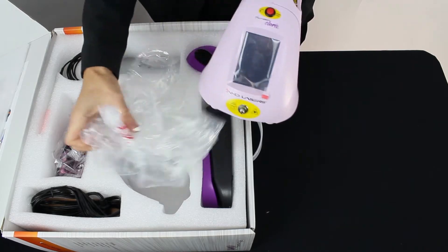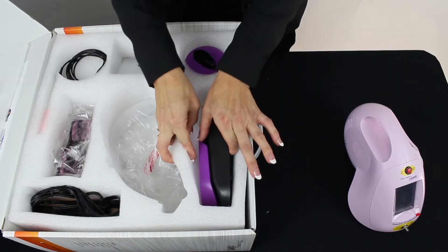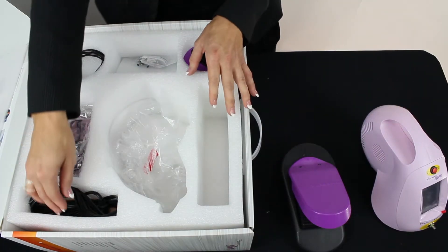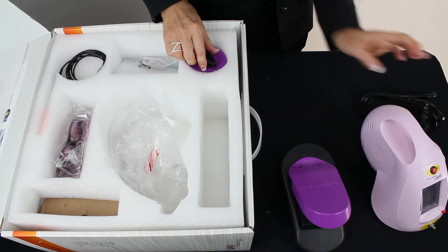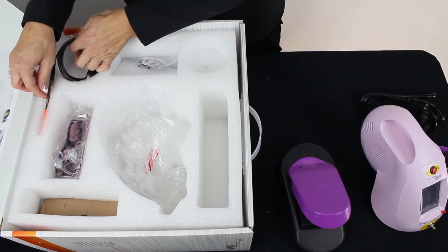The Clario — very compact, easy to roll on a cart in the operatory — wireless foot pedal, here's our power cord, a spool to wind your handpiece on, and our multi-tip handpiece.